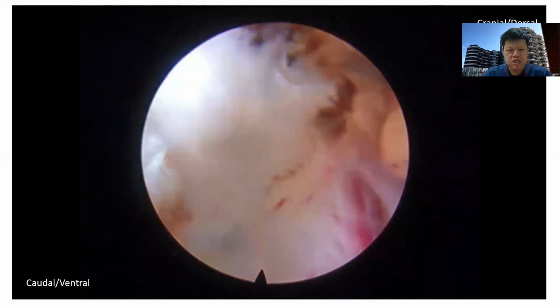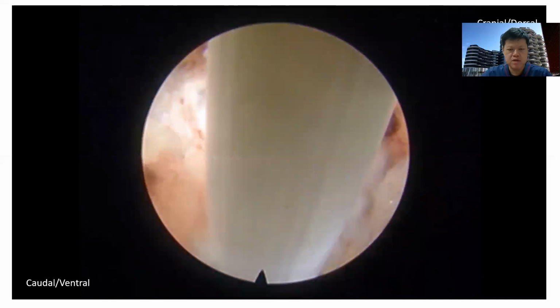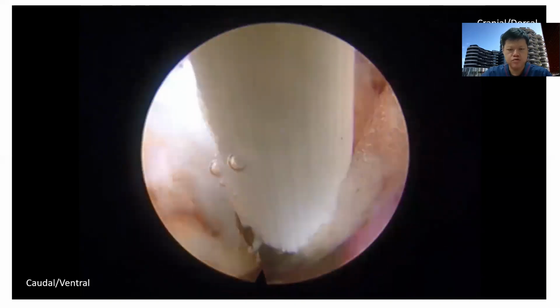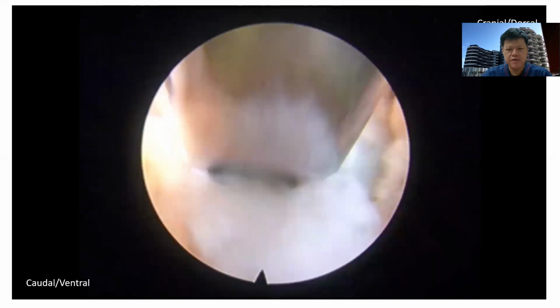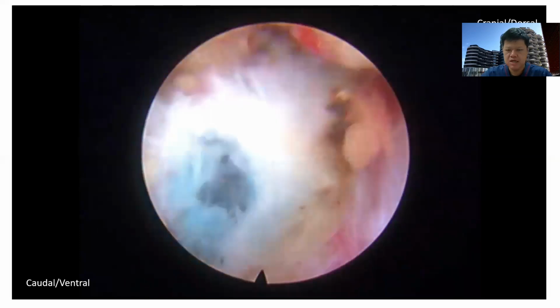is released and discectomy is performed on that. You can do annuloplasty with the radiofrequency ablation as well, shrinking the excessive annular soft tissue while performing discectomy. We explore both the exiting nerve root and the traversing nerve root. If necessary, more foraminoplasty can be performed, and more foraminal ligament can be released.